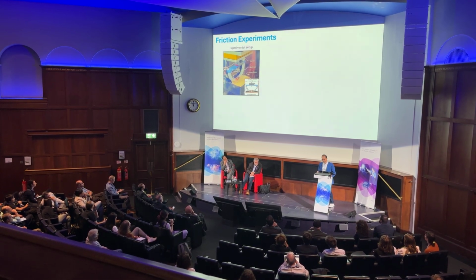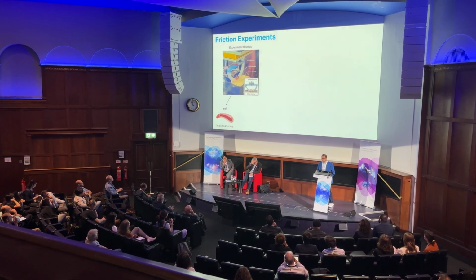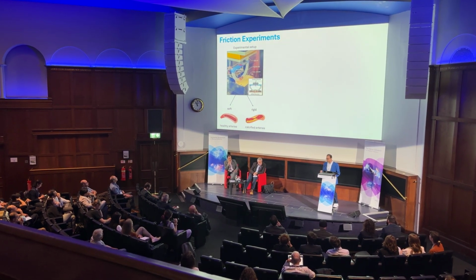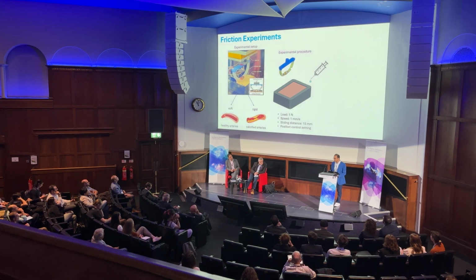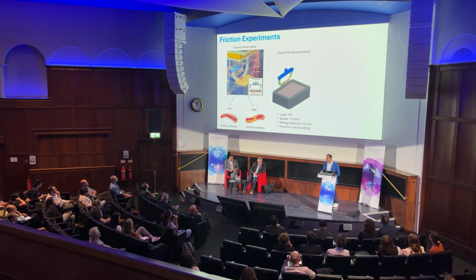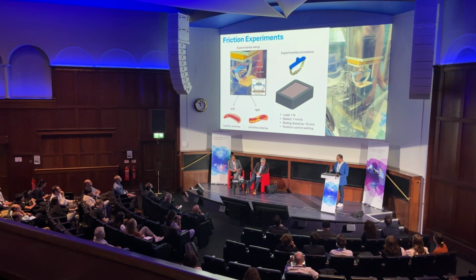So we took these friction control modules, and we started doing friction experiments against ex vivo soft tissue that represents healthy arteries, and also rigid material that represents calcified arteries. The experimental procedure starts by lubricating the surface, pushing the friction control modules against the surface, sliding, measuring forces, and repeating this sequence many times.